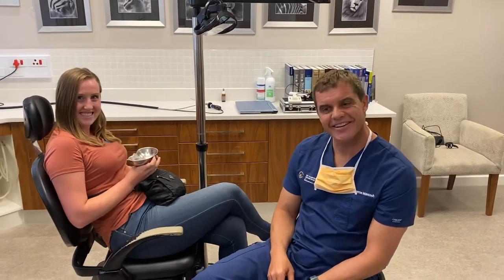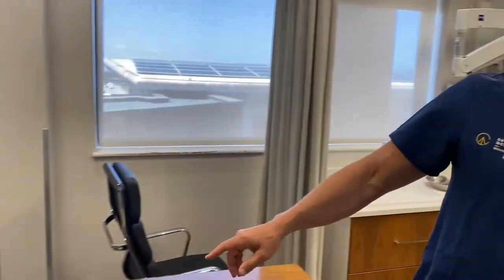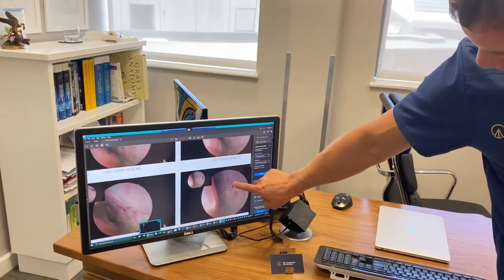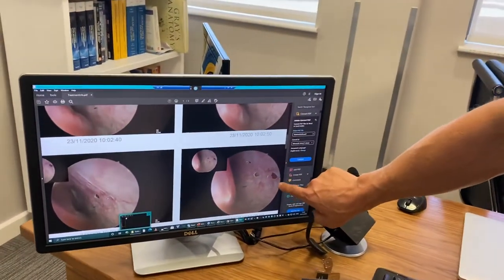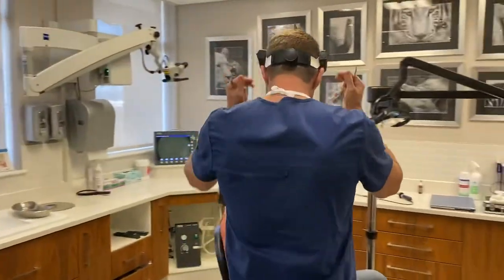So I just want to show you the screen over here. If you look carefully, you can actually see there were a whole lot of perforations — look at these four different perforations. What we're going to do is take out the splints that have been in here for three weeks.